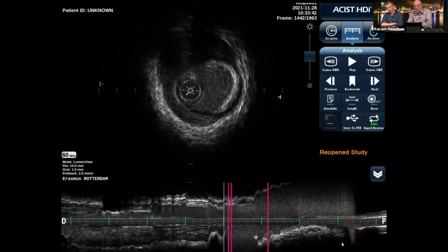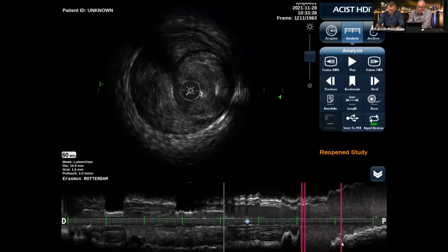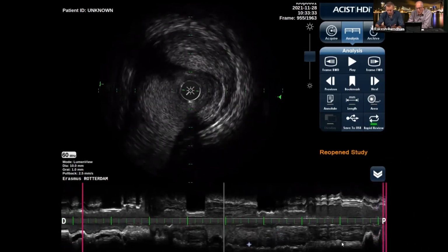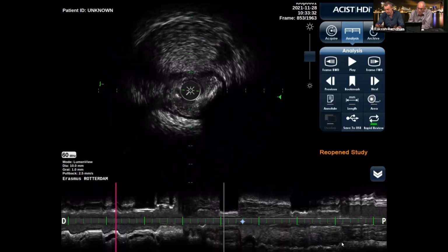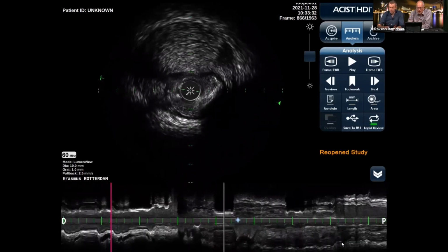Yep. So in summary, hematomas can be appreciated very nicely, both on IVUS as well as on OCT. They can be derived from spontaneous coronary artery dissections, which can be divided into either an intimal or a submedial rupture, either proximal or distal at the site of the hematoma. It can be a spontaneous hematoma. So those are cases with a hematoma without dissection flaps. Yeah. It can be secondary to a plaque rupture, but as Jurgen mentioned, this is extremely rare. But in this case, it could have been the case. But at least it was present.